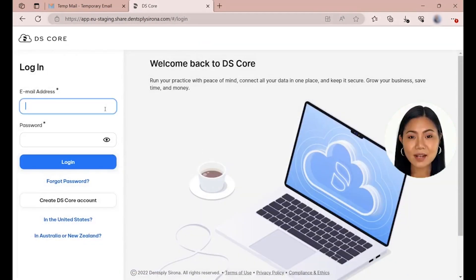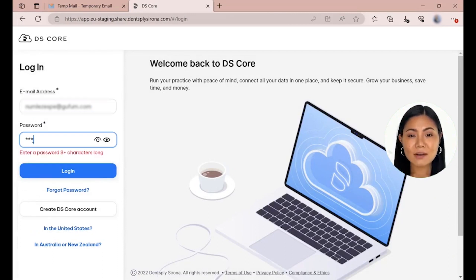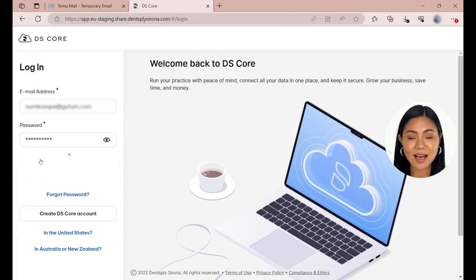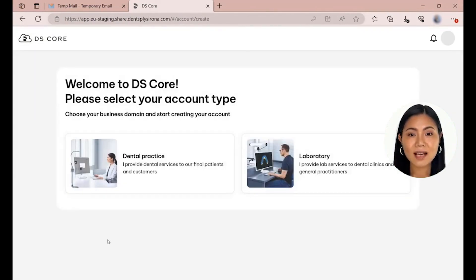Use your verified email address and your chosen password to log into DSCore. To continue with the onboarding process, select Laboratory as your account type.